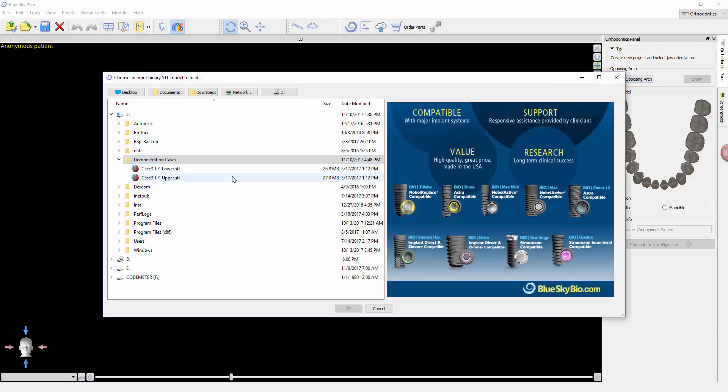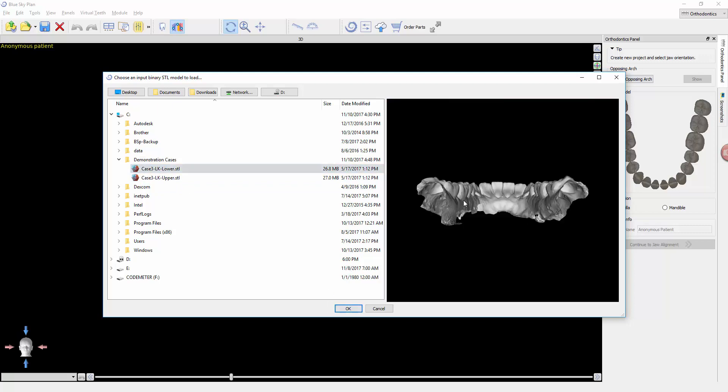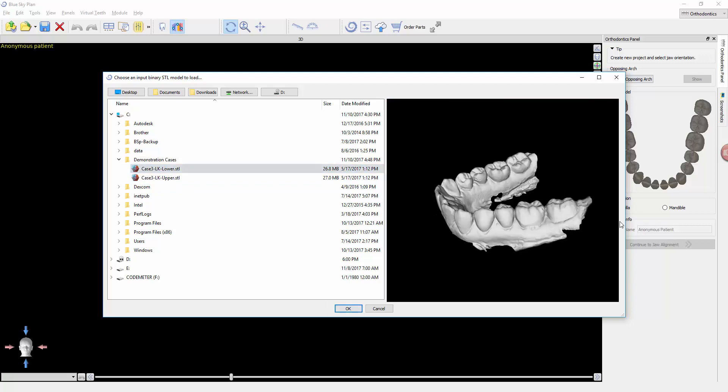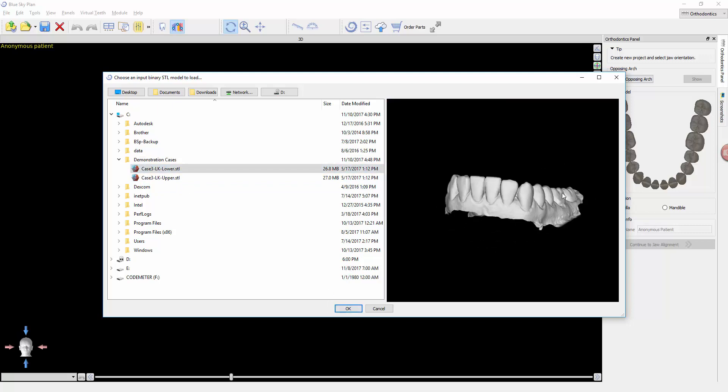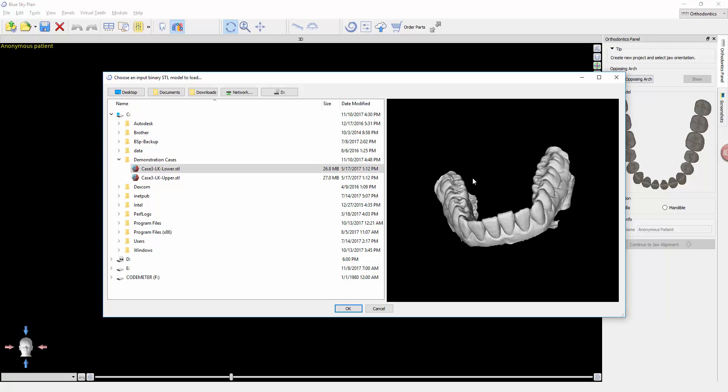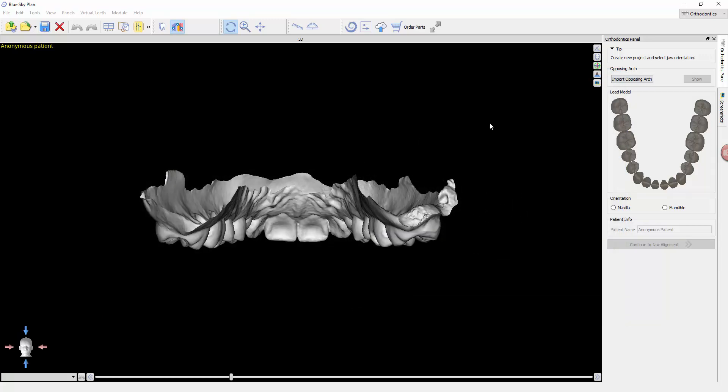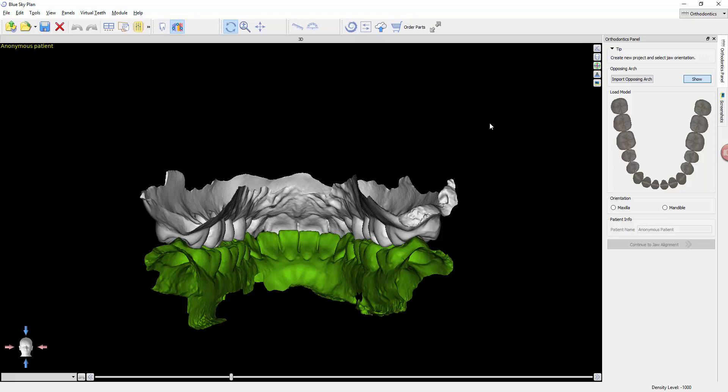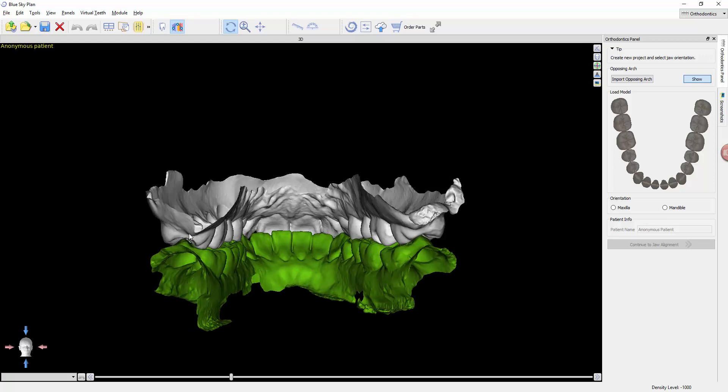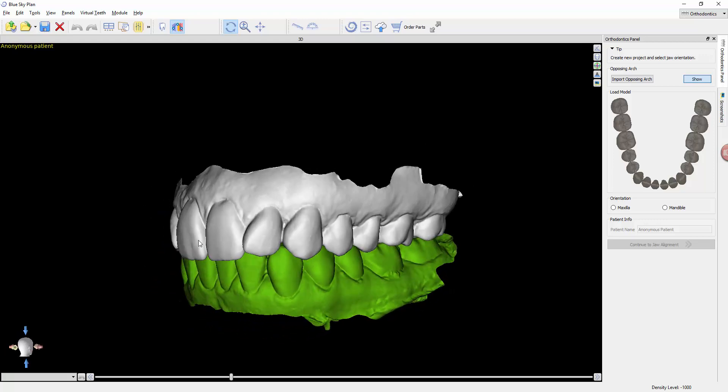Import opposing, we click here. Once again, I'm going to bring in the lower. Wait for it to load. There's the model. Again, you can just take a look at it to make sure it is indeed the same model we're planning to work up. Click OK, and now you can see the two models have been brought in in occlusion.